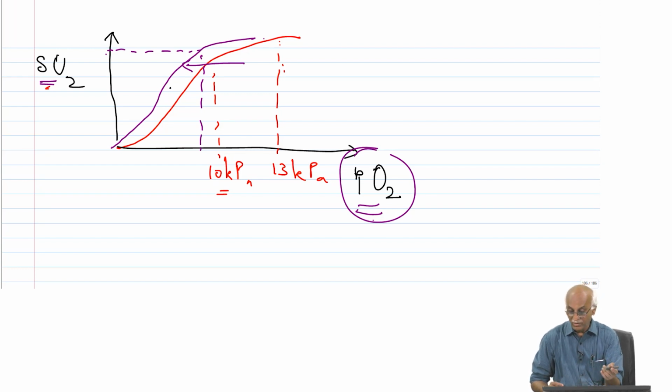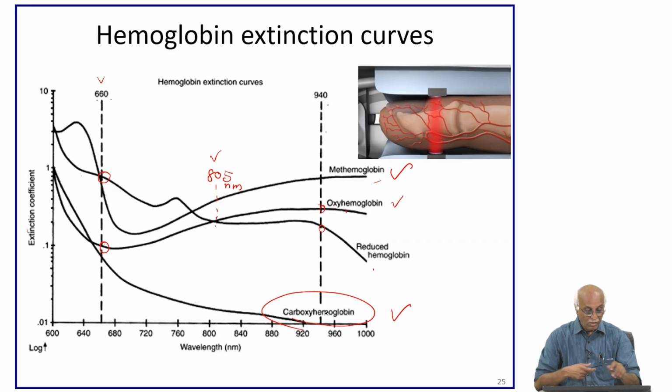So, that is one aspect: some of the researchers are also working to measure carboxyhemoglobin by using one more wavelength. See, now there are 3 components: hemoglobin, oxyhemoglobin, carboxyhemoglobin. So, how will we capture that information? We may have to use 3 wavelengths in order to capture this information.